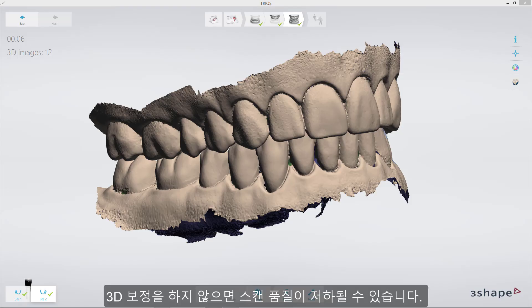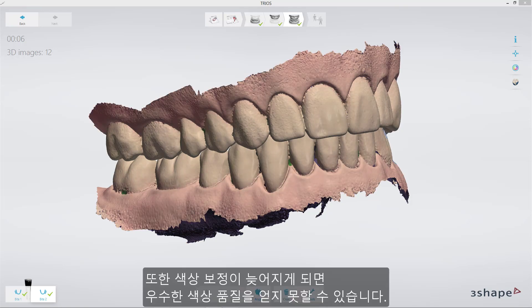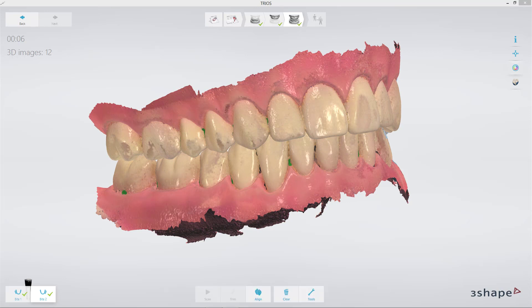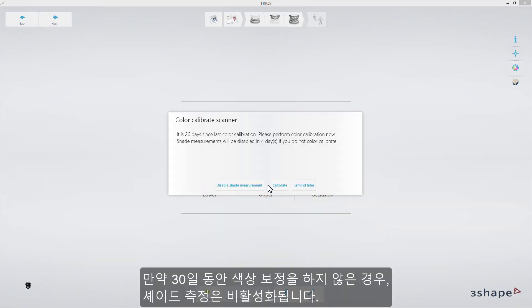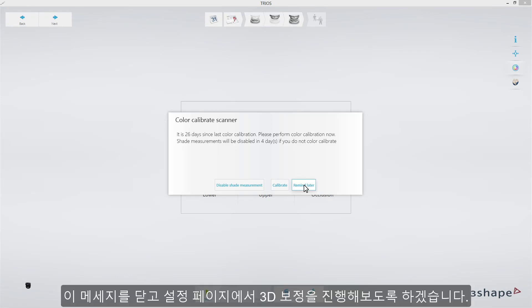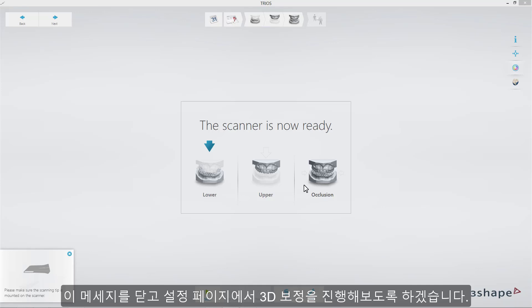Skipping 3D calibration might lead to degradation of quality of the scan. Outdated color calibration may have a negative impact on obtaining optimal color quality. Shades measurement will be disabled if color calibration is not performed for 30 days. I will close the messages and proceed with 3D calibration from the Settings page.